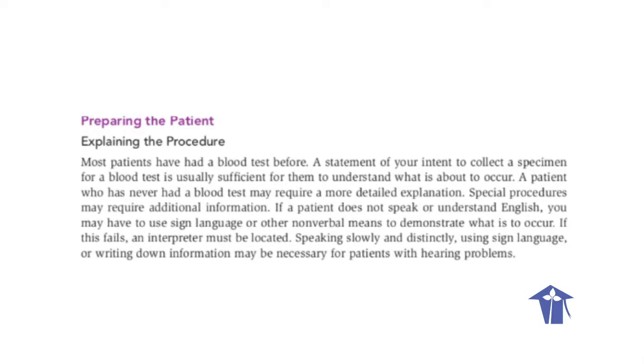Explaining the procedure. Most patients have had a blood test before. A statement of your intent to collect a specimen for a blood test is usually sufficient for them to understand what is about to occur. A patient who has never had a blood test may require a more detailed explanation. Special procedures may require additional information.